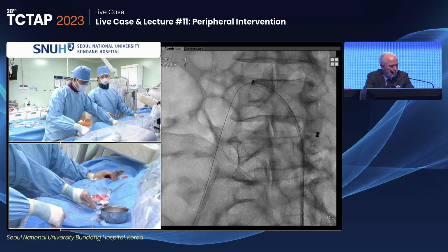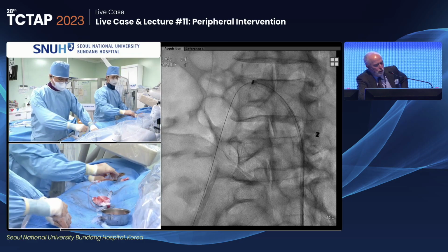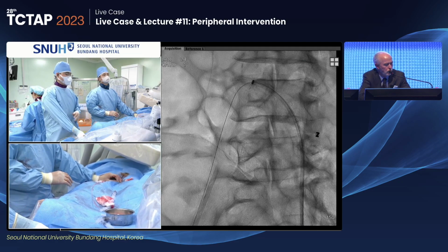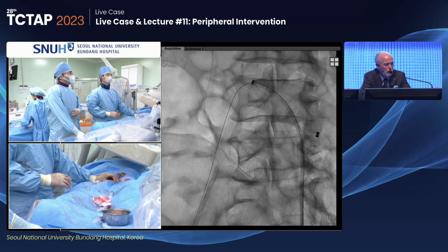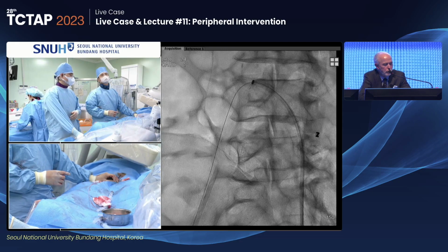And this one doesn't go all the way back to the origin, so you have that. Right. So it's probably safer that way. And it looks like the reentry was above the origin of the internal iliac artery, so there should be no risk of closing the internal iliac when we stent. But I'm not sure. The dissection can progress to the external iliac artery, so yeah.